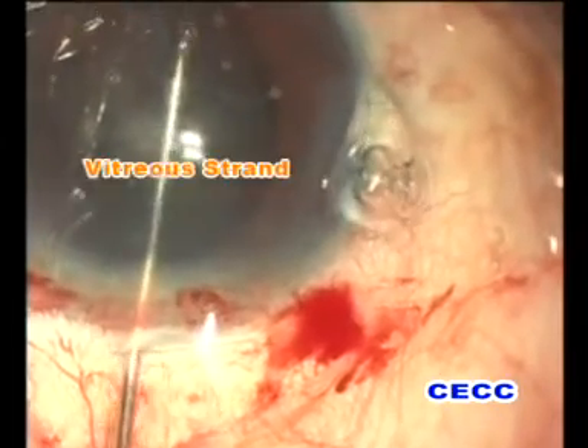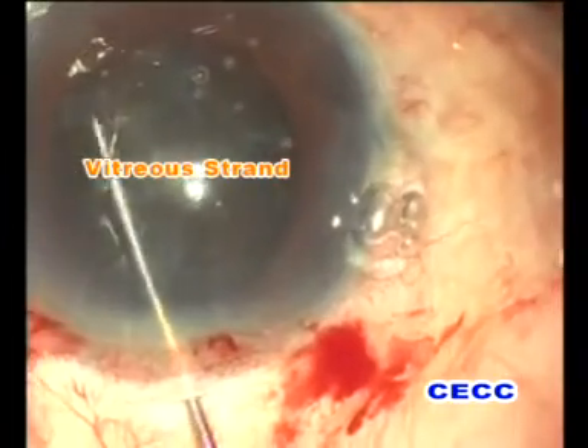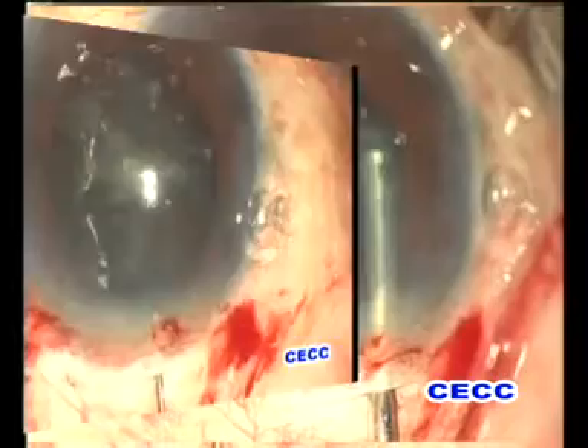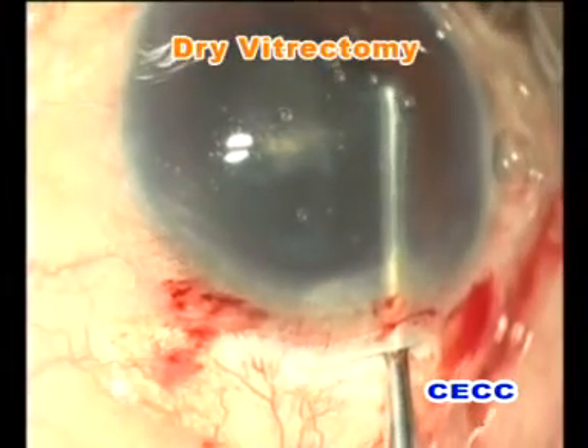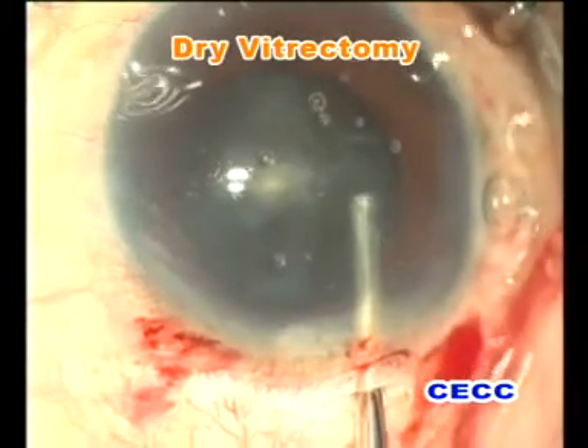We should never use a hook to draw the vitreous out of the incision because that will apply undue traction on the vitreoretinal base. The next step was to remove the prolapsed vitreous from the anterior chamber. This was achieved by dry automated anterior vitrectomy.